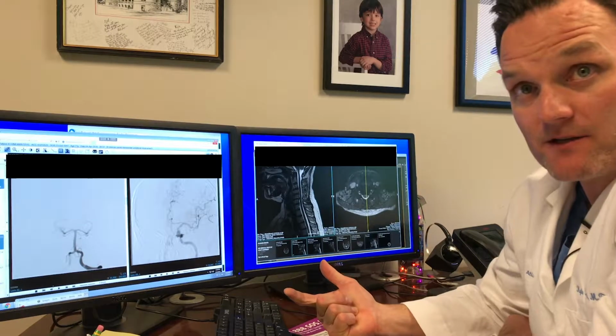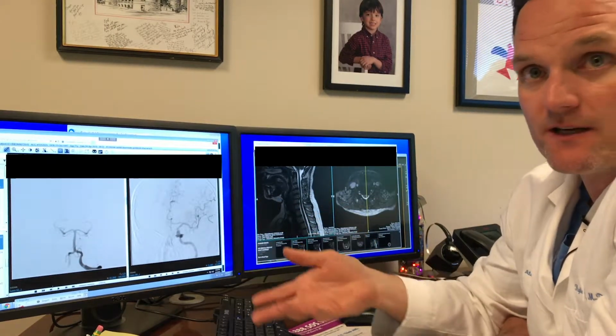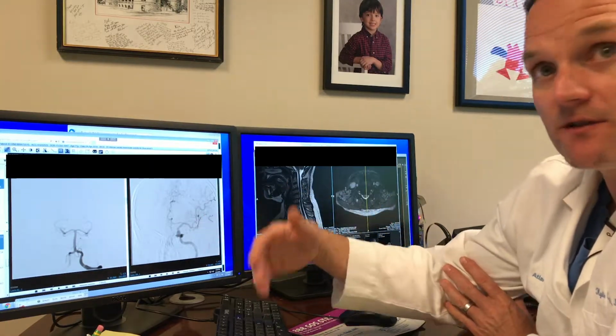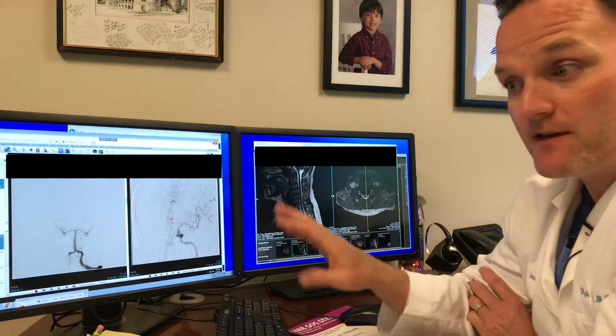It's an invisible dye essentially that we inject through the catheter. It's radio opaque, meaning it shows up on X-ray, but it just looks like clear liquid if you were to look at it in a cup or something on the table. But it's specially made to go inside of the blood vessels. It doesn't hurt the blood vessels. It doesn't hurt the patients, and then it gets metabolized and excreted.